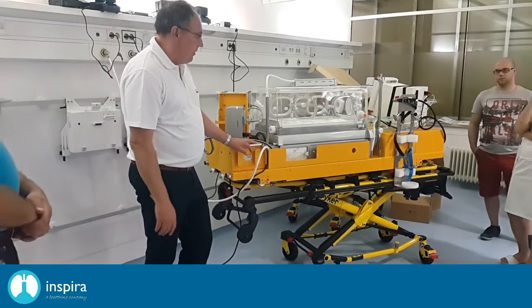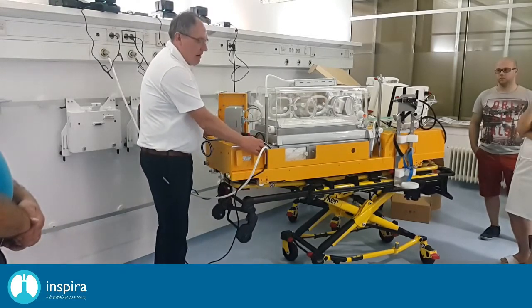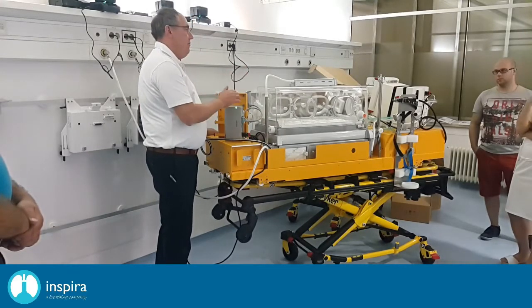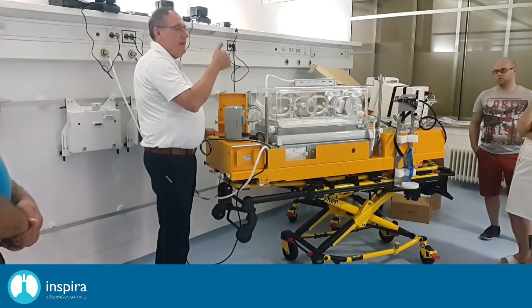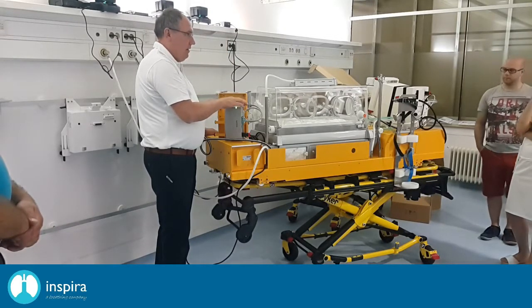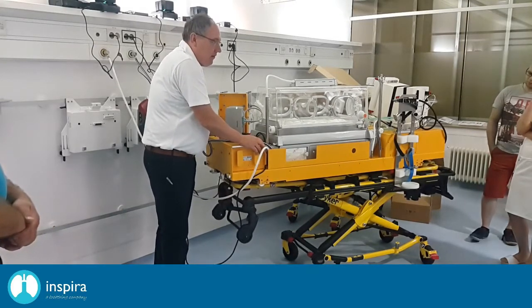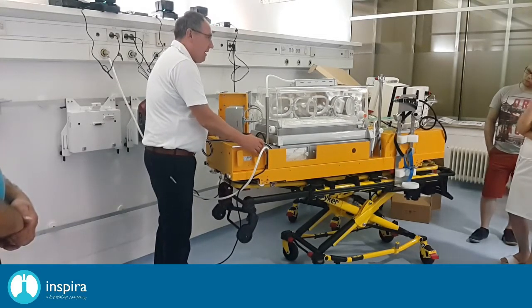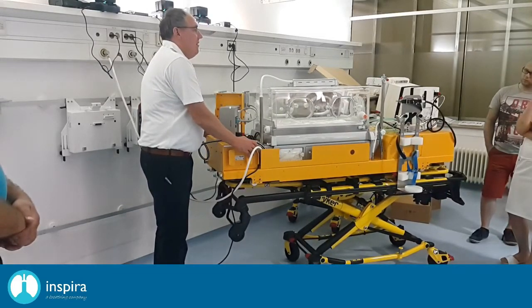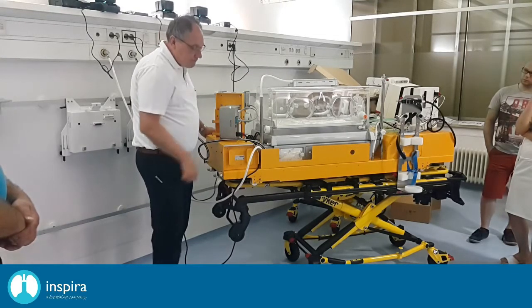This is quite important. And also as a safety notice, please bear in mind that you are not allowed to handle this type of equipment as one person. At least you need to be two people to handle such a system, okay? To avoid accidents, and we also have accidents with stuff which is lying underneath such an incubator, okay? It's necessary that you have two people, one on the front end and one on the back end, okay?